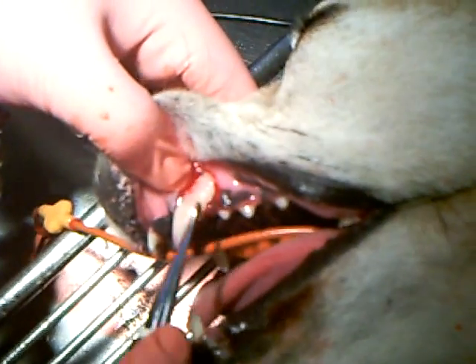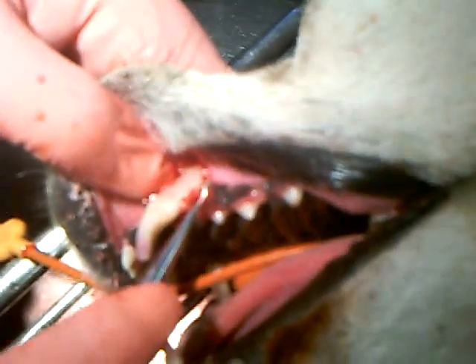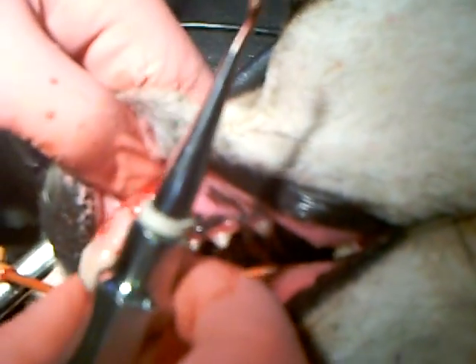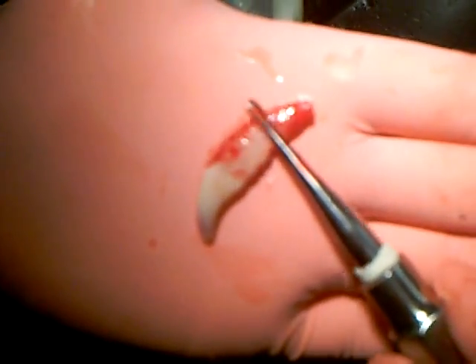So now what we're going to do is take our elevator, place it underneath the tooth itself, and elevate it out of the socket here. You can see how big that root is. This is the crown here — this is the only part of the tooth that you can see from the outside, and all of this was hidden underneath the gum line. But you can see we got it all out, so that's good news.